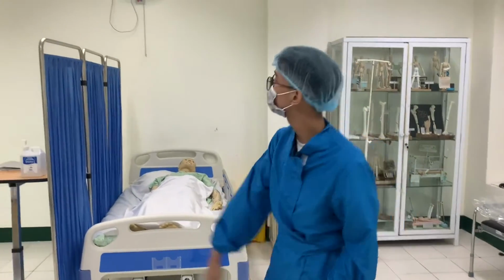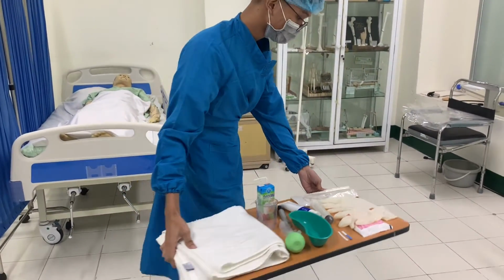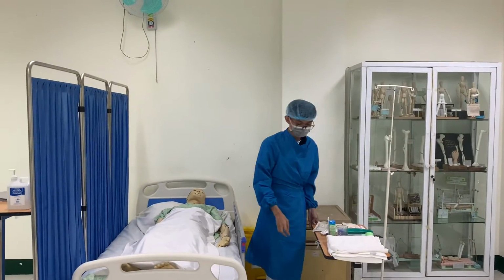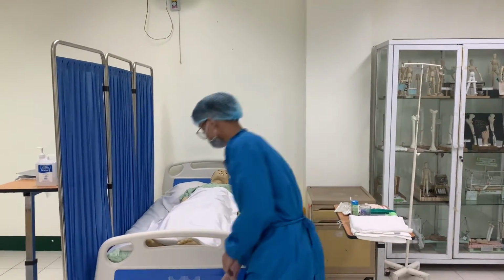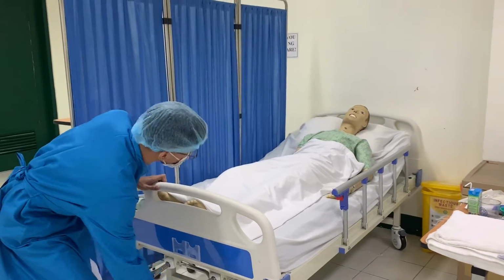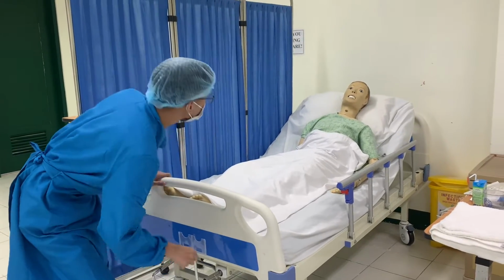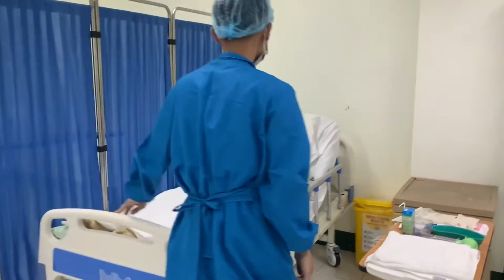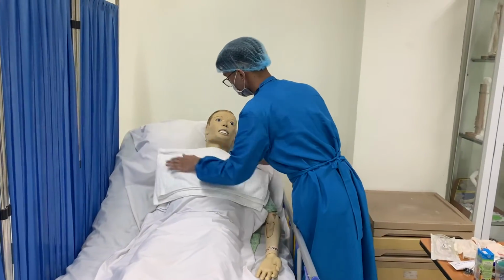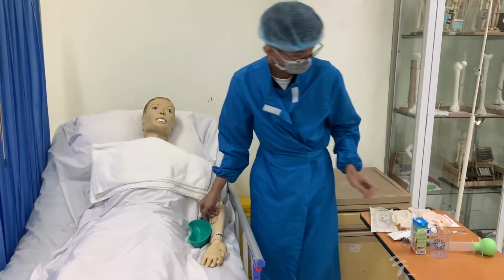Close the patient's bedside curtain or door. Raise the bed to a comfortable working position, usually elbow height of the caregiver. Assist the patient to a high Fowler's position, or elevate the head of the bed 45 degrees if the patient is unable to maintain an upright position. Drape the chest with a bath towel or disposable pad. Have an emesis basin and tissue handy.